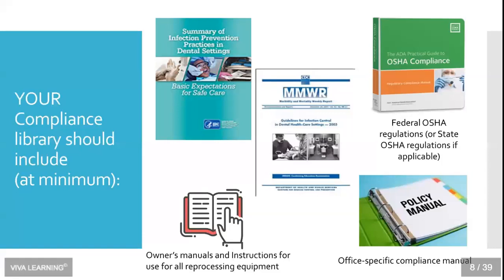The first part is to assess our policies within the practice, and the second portion is to watch hands-on what we're physically doing on a day-to-day basis for compliance. I encourage all of you to be familiar with this document wherever you practice around the world. It is an excellent document, and even if your protocol varies ever so slightly, the principles behind infection control will remain the same. So I encourage all of you to be familiar with this.